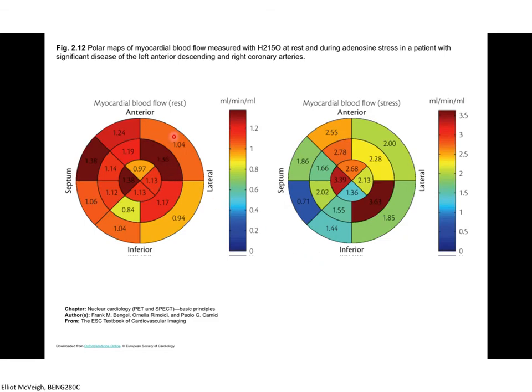And then in its lowest resolution form, that bullseye map breaks the heart down into those traditional regions or areas that we discussed before. You have a map of this on one of your slides where here's the bullseye with the septum on this side. The patient's right is over here, their left is over here, their back is here, and their chest is here. So this is anterior.